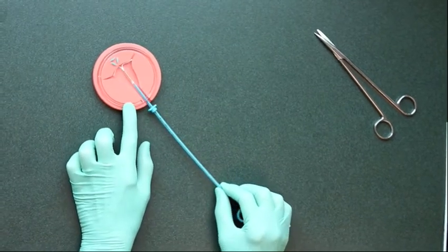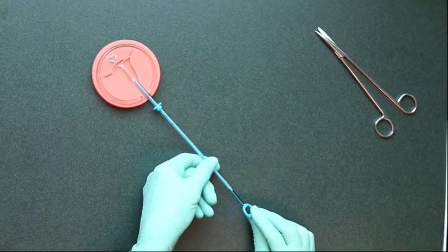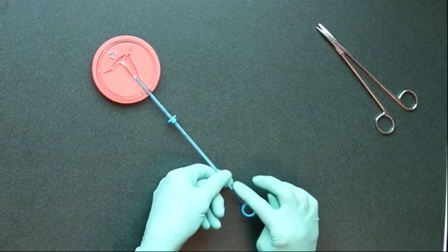Then advance the IUD to the fundus and withdraw the insertion tube to the ring.